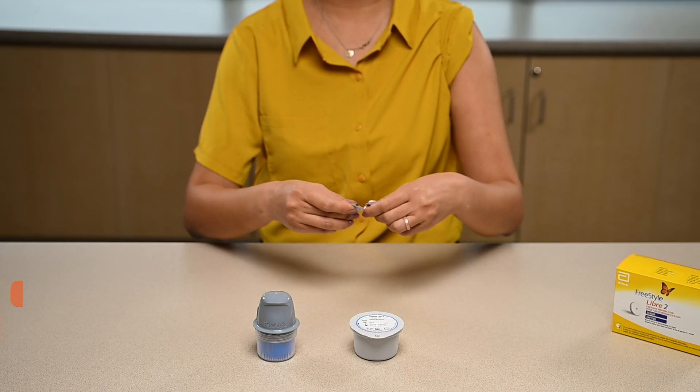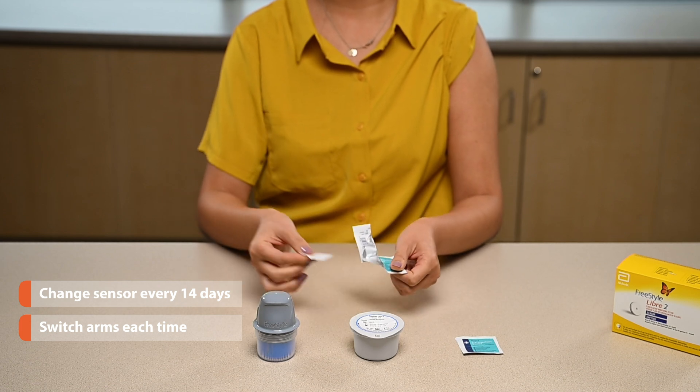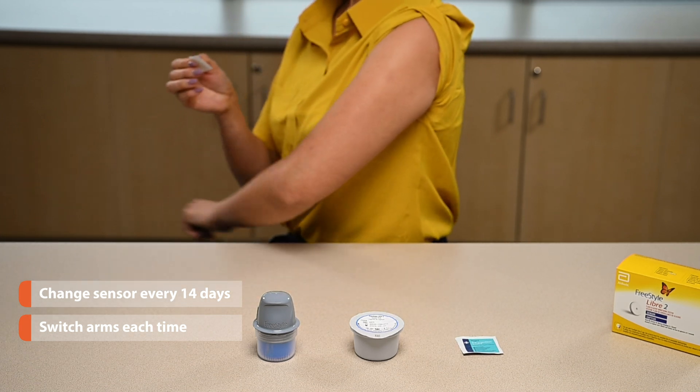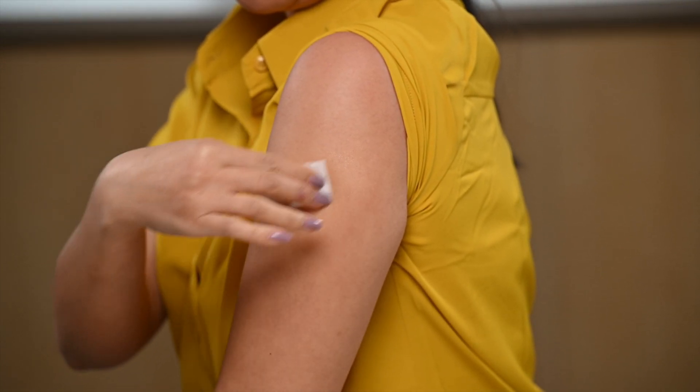Remember, the sensor needs to be changed every 14 days. We suggest switching arms each time you change your sensor so your arm doesn't get too sore. Clean the spot with an alcohol wipe and let it dry.